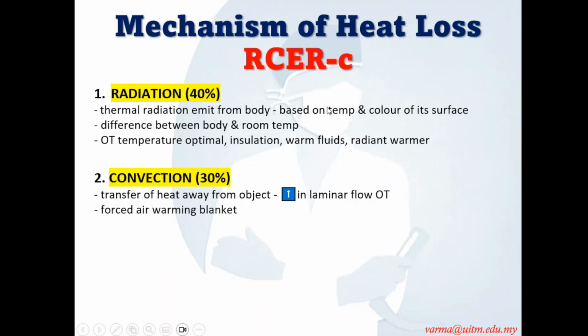Next is evaporation. For the process of evaporation, heat is taken away from the body. When water vapor is evaporated, the heat is lost together with it. It is mainly from moist areas in surgery. That's why, if the surgeon opens up the abdomen, we say please cover it up, don't leave it open. Unnecessary areas which are not being operated on at the moment, don't leave them exposed.